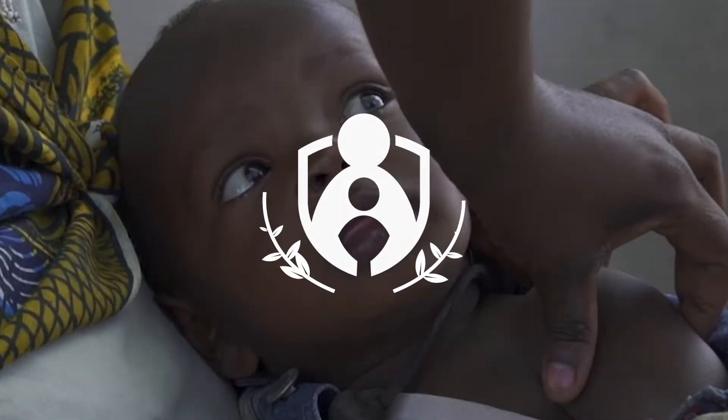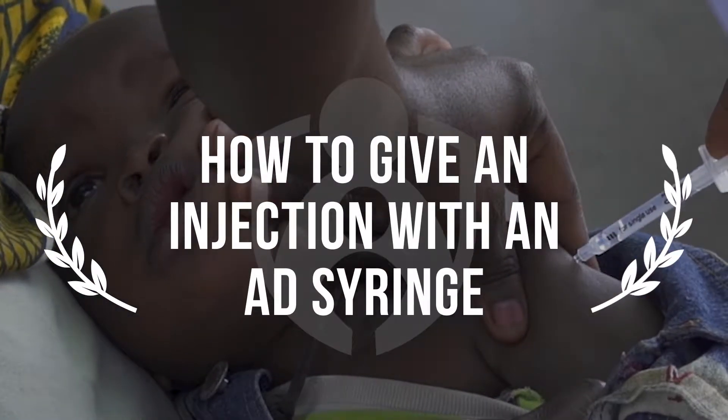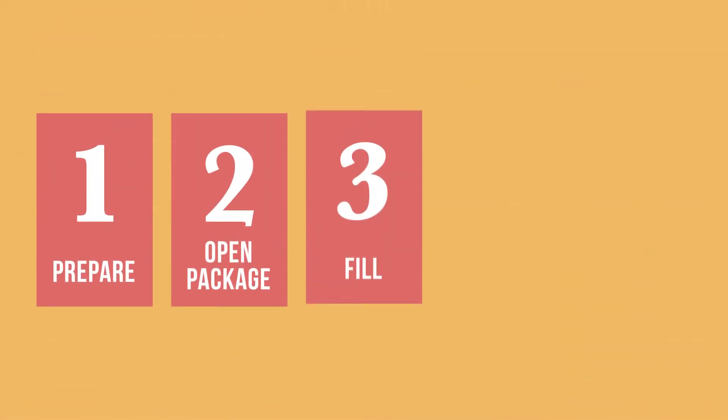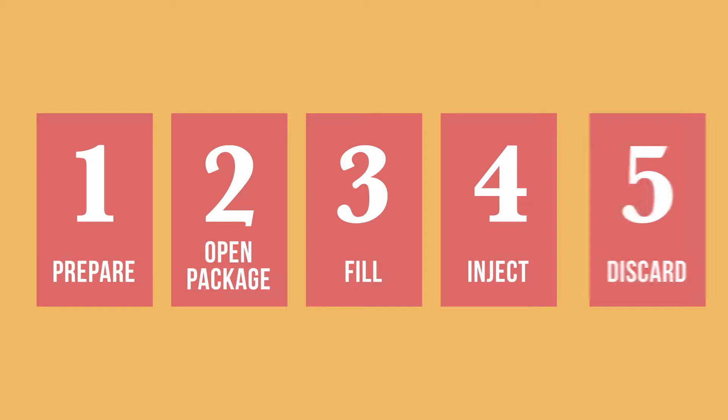One of the ways to keep children safe from vaccine-preventable disease is to make sure that the injection itself is safe. In this video, we will show you the general steps to follow when using an auto-disable or AD syringe, which is considered to be the safest type of syringe for administering vaccines.